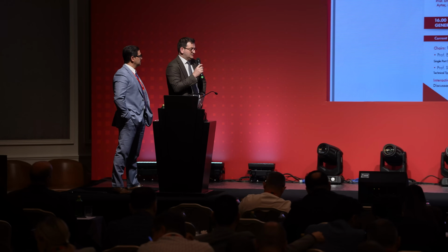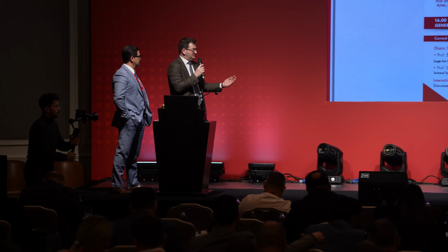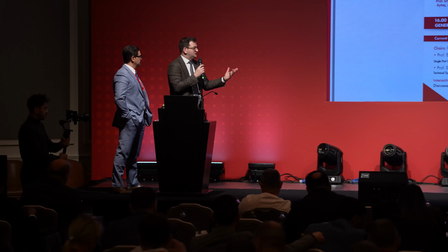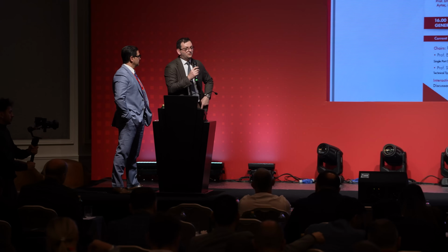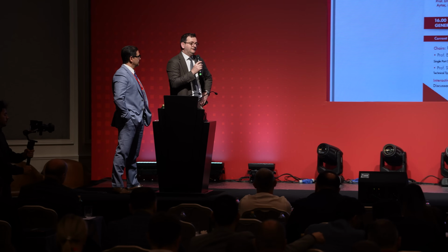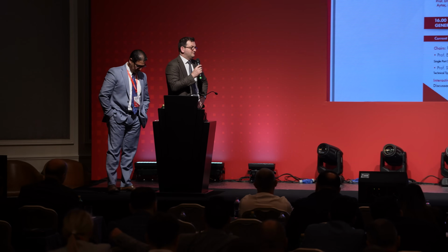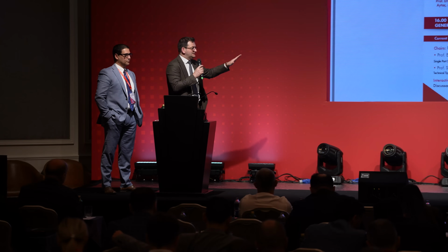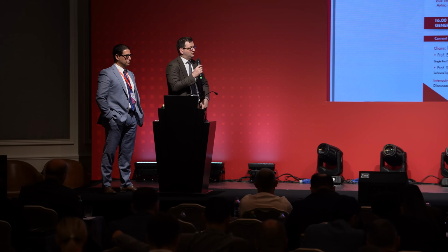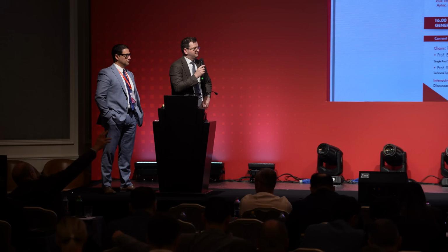Now we standardly do the TME and CME for every case. I mean, if it is a T2 tumor, we do CME. If it's a T3 tumor, we do CME, which is our standard, because for the sake of apical lymph node positivity and other tumor deposits, I think those arguments will continue, and the single port platform is not the top. So it is just one step in the evolution process. So I can apply both of them, depending on the patient characteristics.